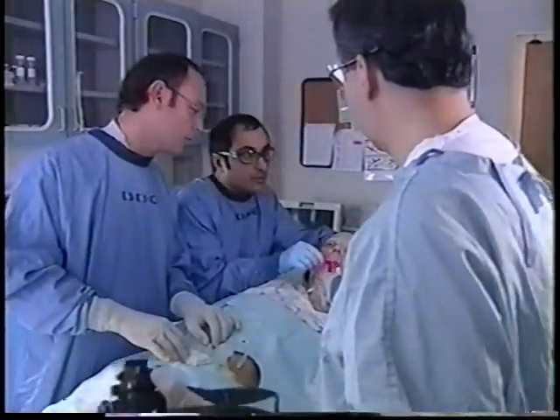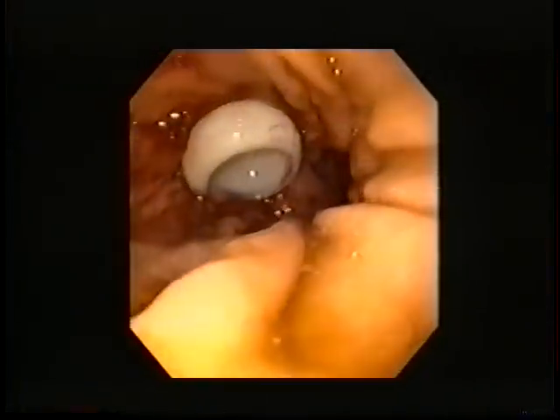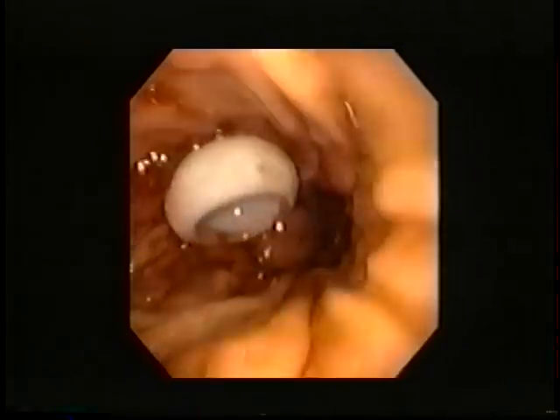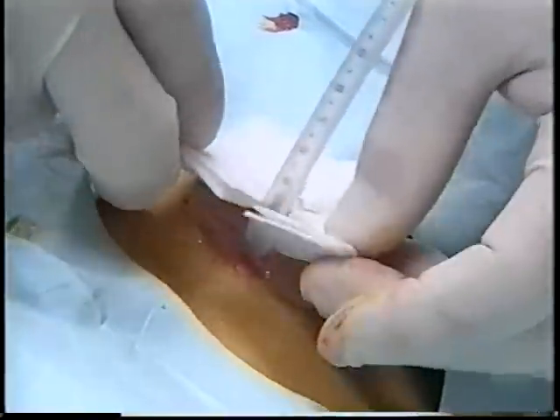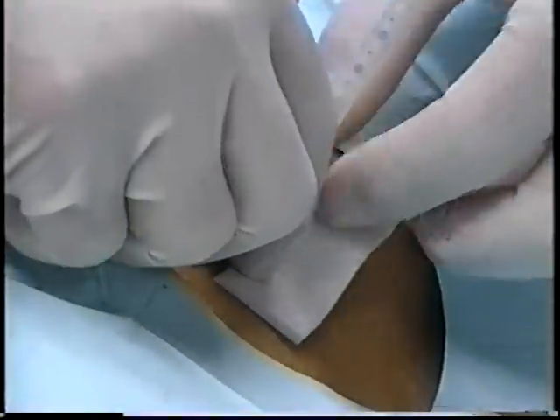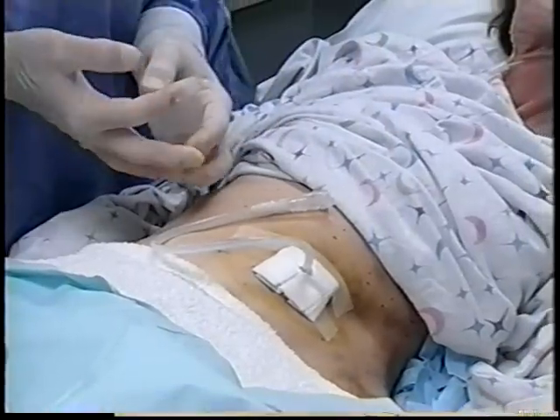The endoscope is reinserted to confirm proper positioning of the internal bolster against the gastric wall. The external bolster is adjusted as necessary so that proper tension is achieved. A sterile dressing is applied to the abdominal entry site. 24 hours after the PEG procedure is complete, the tube can be utilized for feeding.